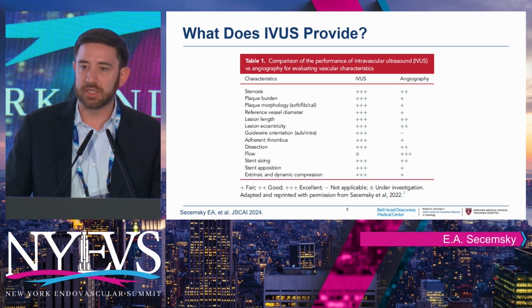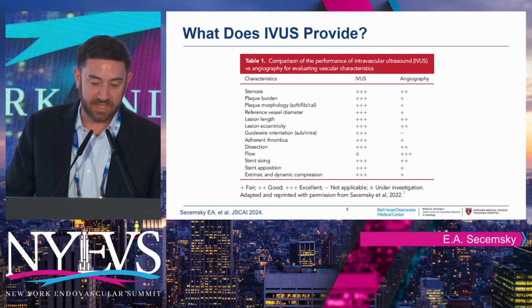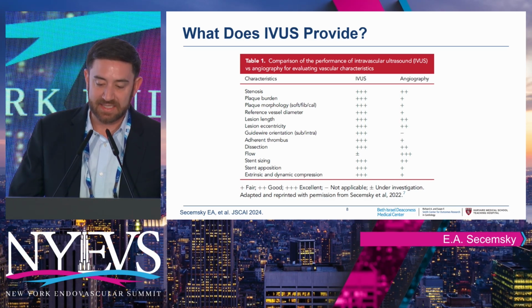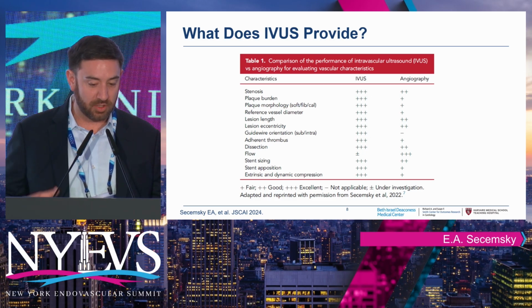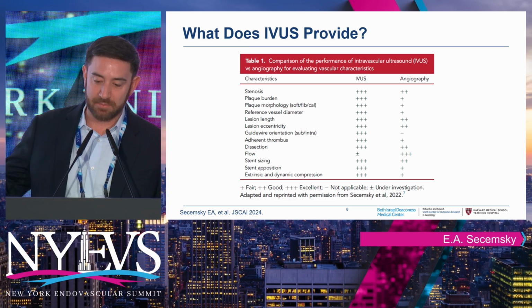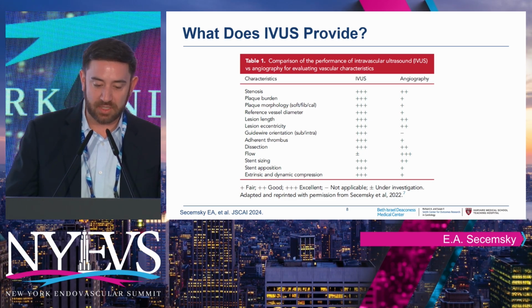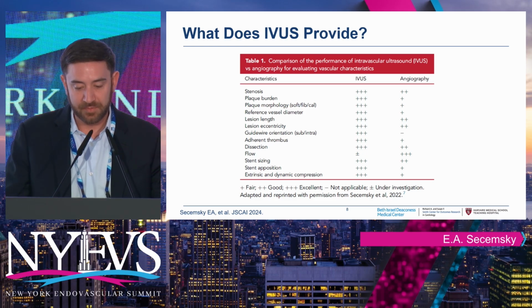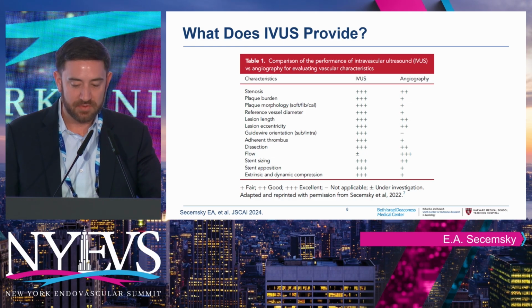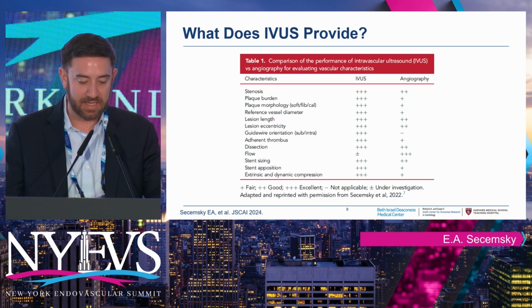And so we get a much better understanding of stenosis and plaque burden, as Miguel just showed us. We saw also with Miguel understanding that guide wire orientation. Are you in that subintimal space? When you're looking at this, as soon as I saw it, you look at so many of these, I already knew exactly where he'd exited and entered. He did a wonderful job demonstrating how to mark this on his angiogram to avoid it or be different in that territory. And then also looking at dissection and thrombus is critical. Flow is something that we're working on, and very heavy IVUS users have a lot of comments on the ability to look at flow, in particular with ChromaFlo, but that has not been as adjudicated yet.